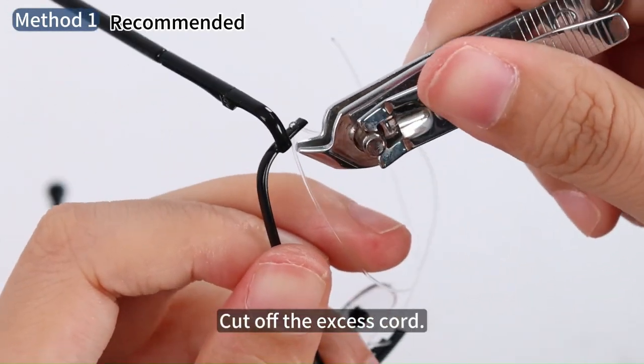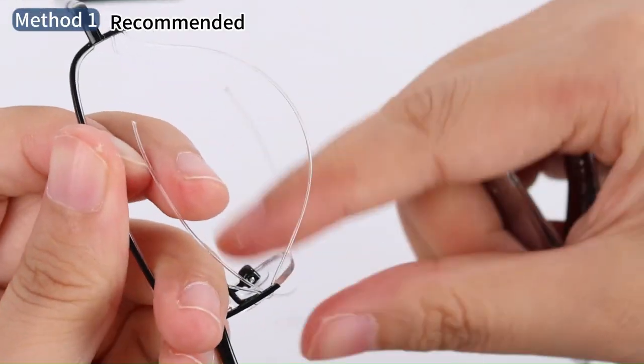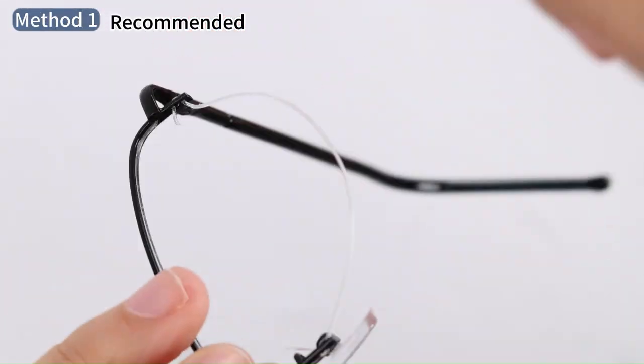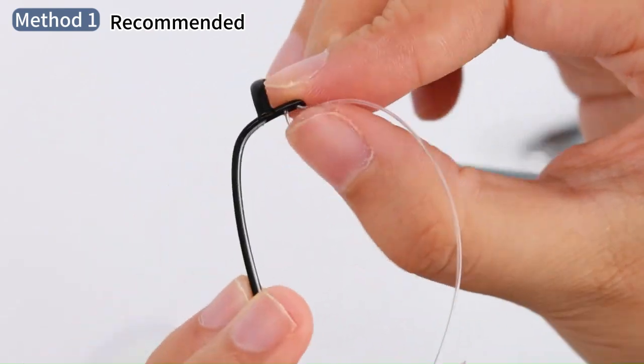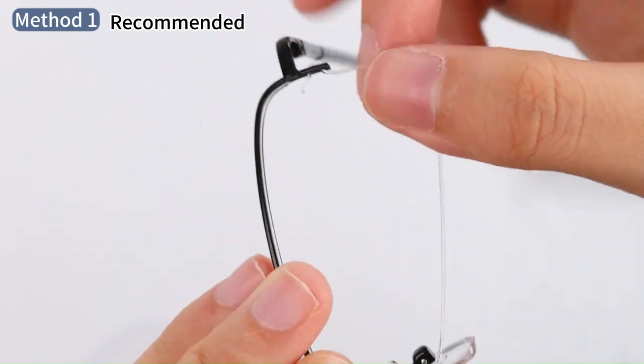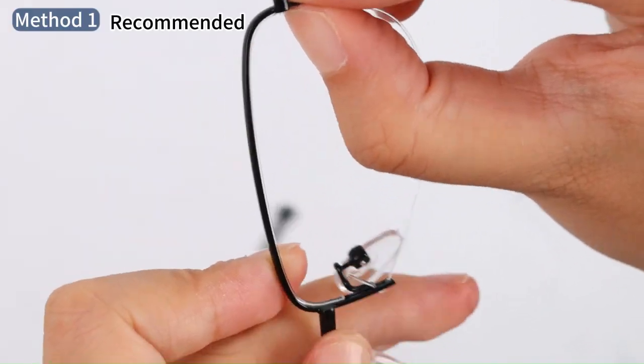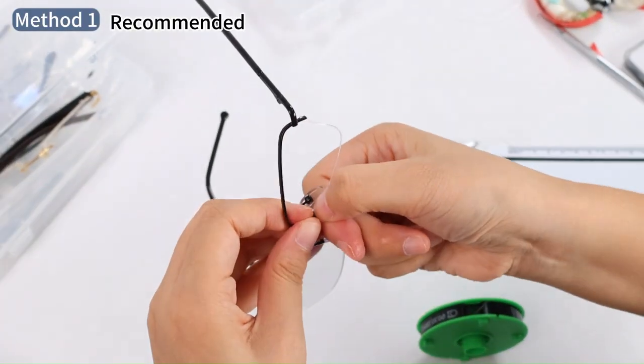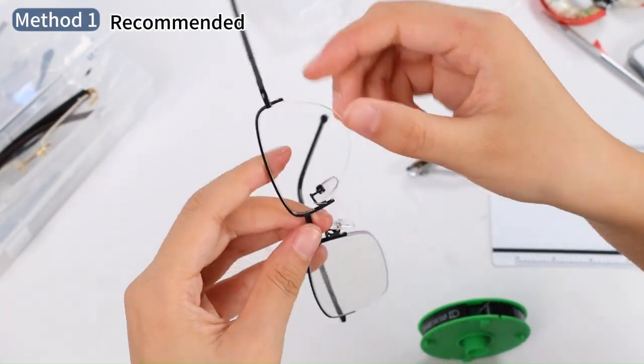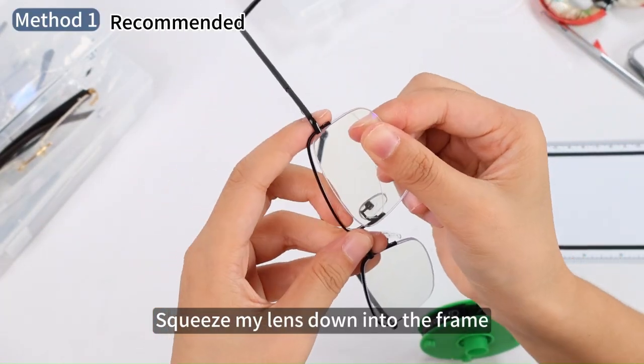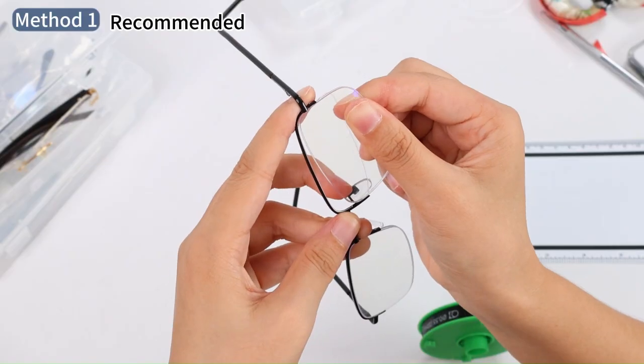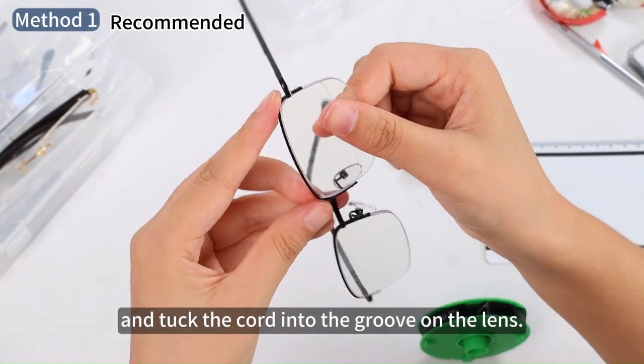Cut off the excess cord. Hide the cord. Squeeze my lens down into the frame and tuck the cord into the groove on the lens.